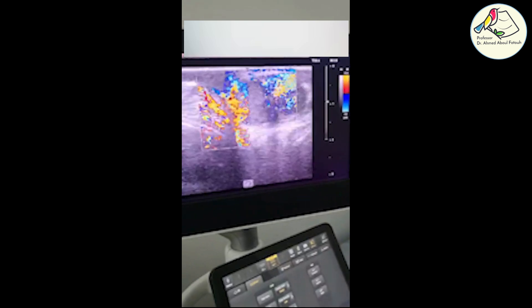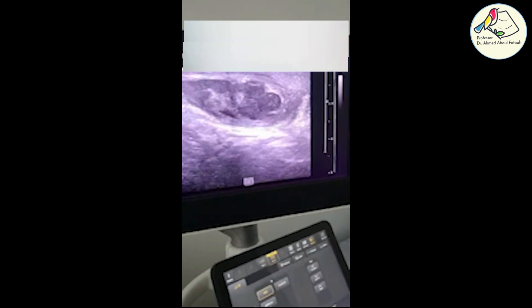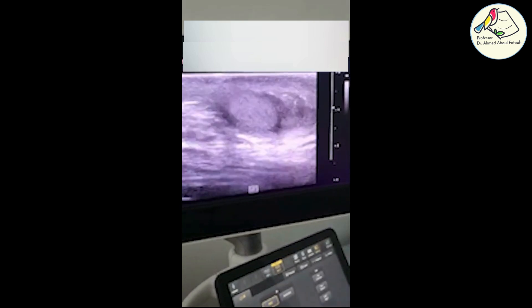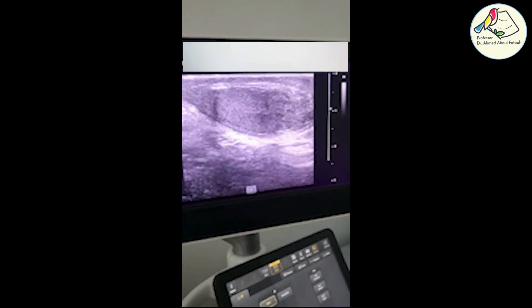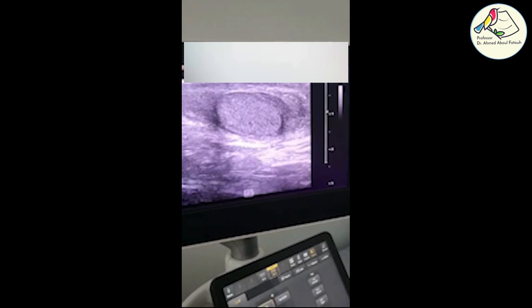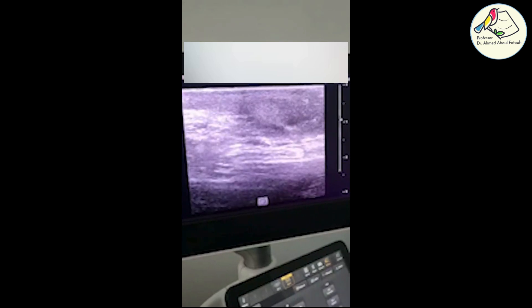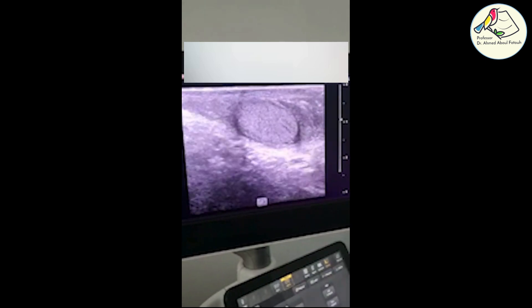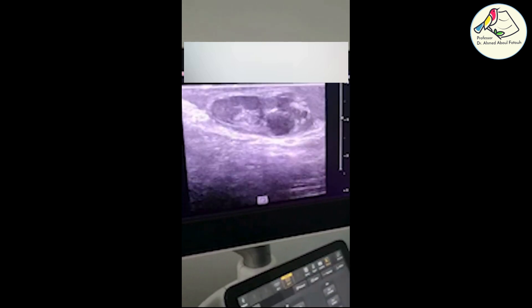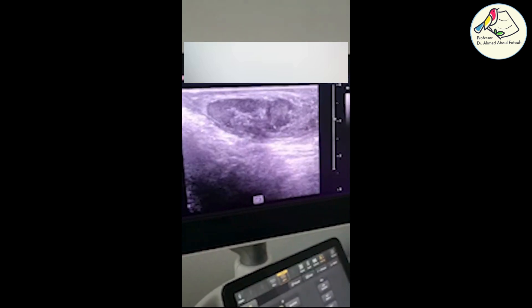In the longitudinal scan, we can have a misleading appearance, but let us confirm the sign again. Here is the testicle — concentrate on the testicular tissue itself. It should look like this. Here is the medial aspect of the testicle. Now moving to the lateral side.